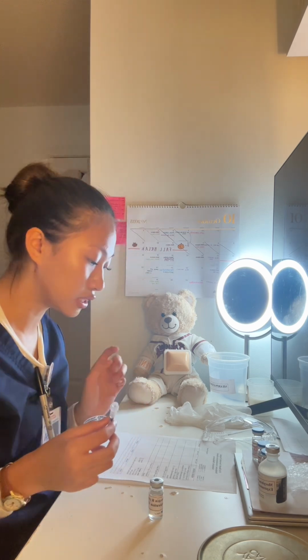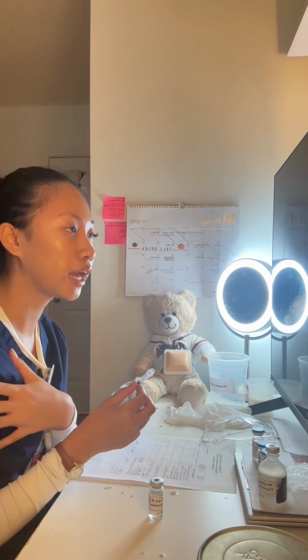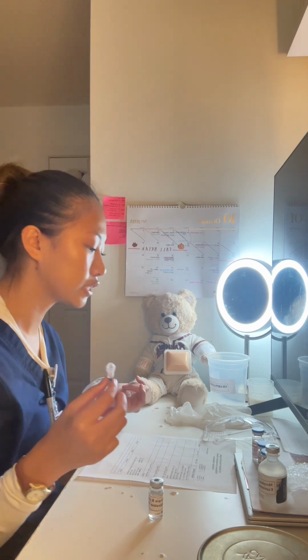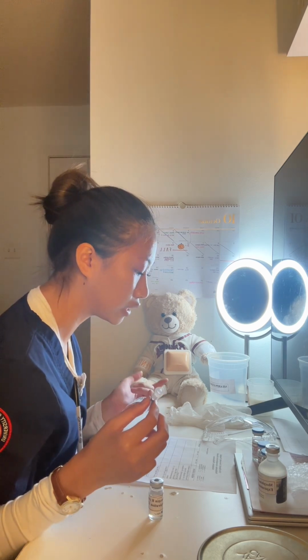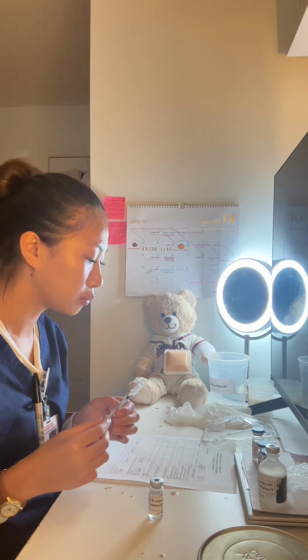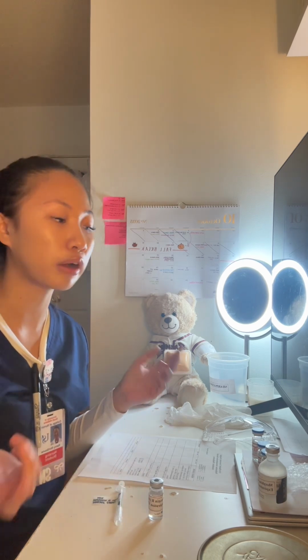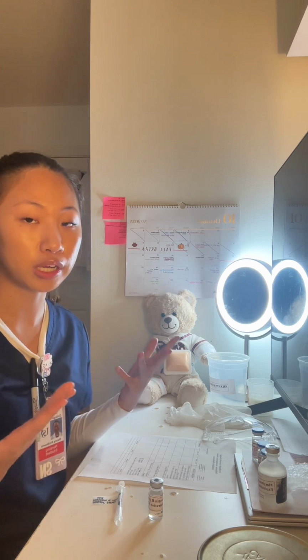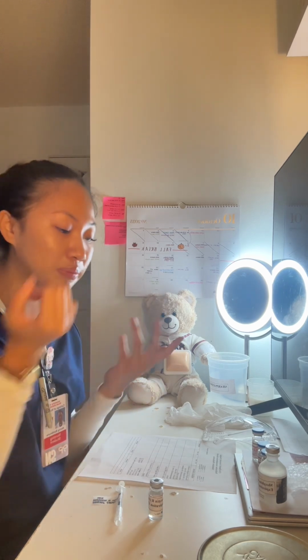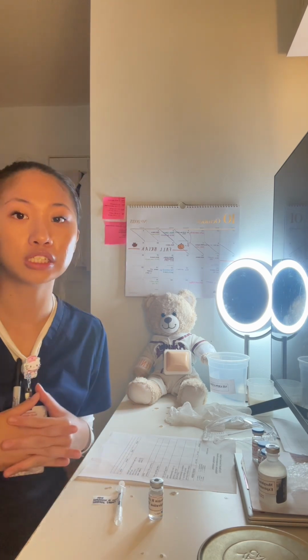And I'll be giving this subcutaneously, so I can give this at his dorsolateral aspect, or I can give this on his abdomen or his vastus lateralis. It does say on his MAR that I can give it on his abdomen or vastus lateralis. And I will be giving this 30 minutes before his meals since he is a diabetic patient, so I would need to administer this before his meals. So I'm going to go ahead and check here. Yep, it's almost meal time. He still hasn't received his insulin shot. So that completes my second check of accuracy.